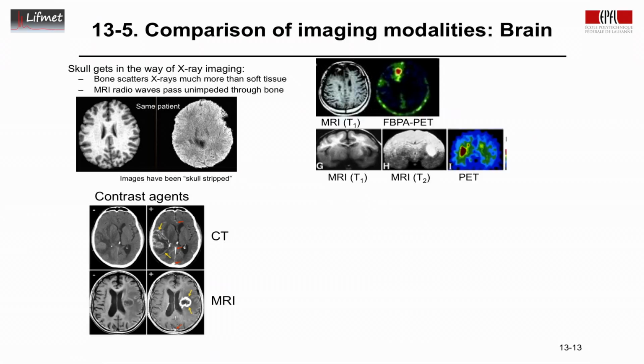Okay, so the top row is the CT scan. We can see the bone very bright. The soft tissue contrast is not exquisite. In the MRI, we see the fat, and we have exquisite soft tissue contrast. And we see on the left the pre-contrast agent administration, so that's a native image. We see something is going on here.